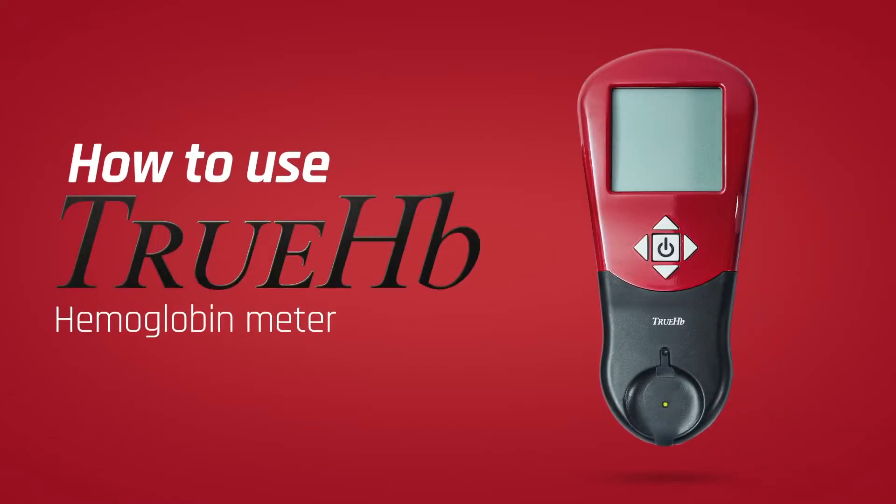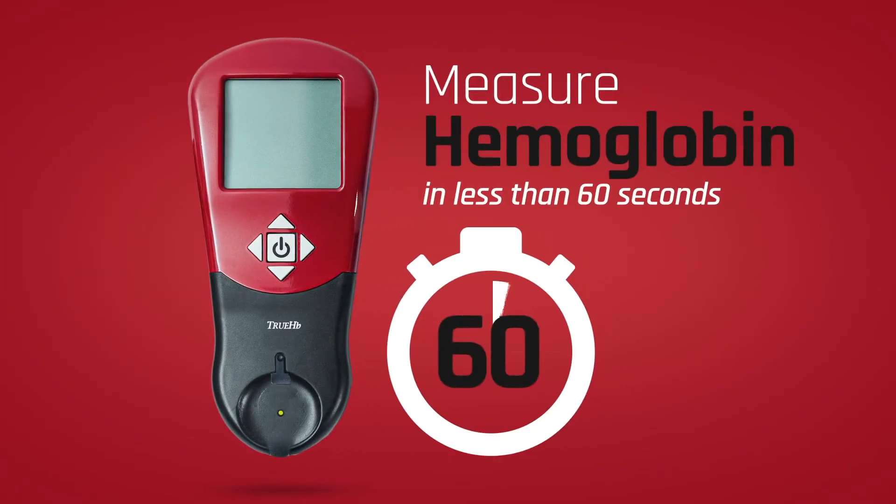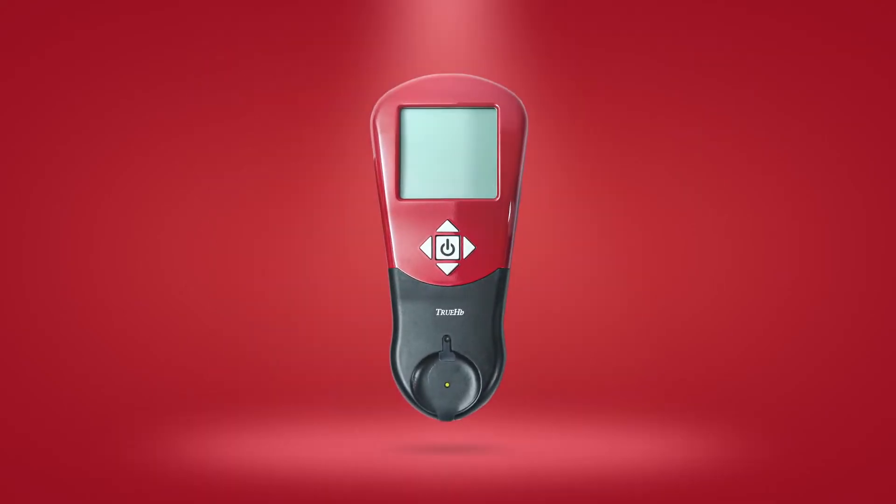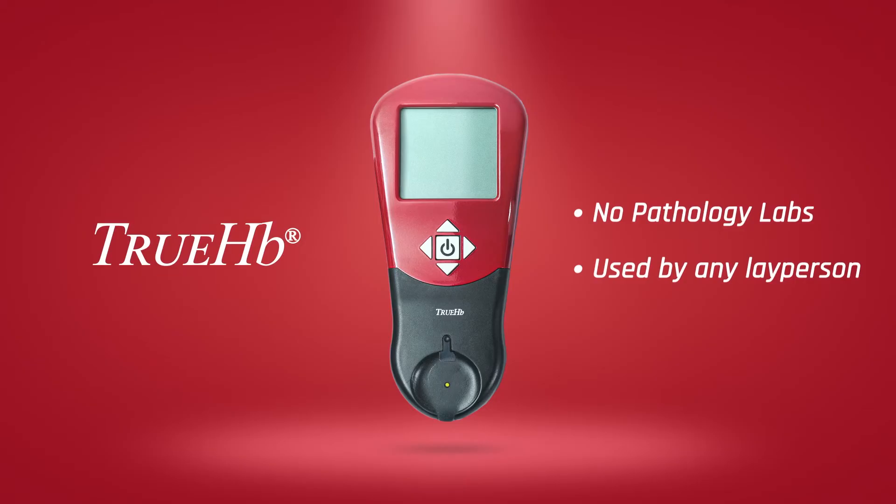In this video, we walk you through how to use TrueHB hemoglobin meter. TrueHB hemoglobin meter is used to measure hemoglobin in the whole blood in less than 60 seconds at home. Now you don't have to go to the pathology labs to get yourself tested.